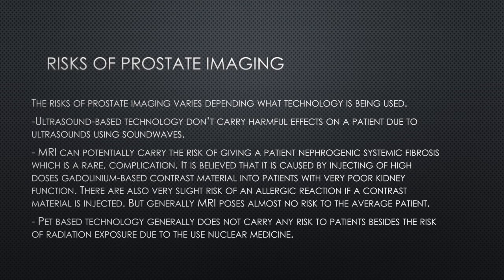If an ultrasound-based technology is being used, they don't carry any harmful effects on an average patient due to ultrasounds using sound waves. If an MRI-based technology is being used, they can potentially carry the risk of giving a patient nephrogenic systemic fibrosis, which is a rare complication. It is believed that it is caused by injecting high doses of gadolinium-based contrast material into patients with poor kidney function. There are also very slight risks of giving a patient allergic reaction if a contrast material is being injected.